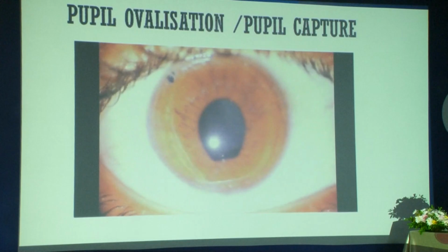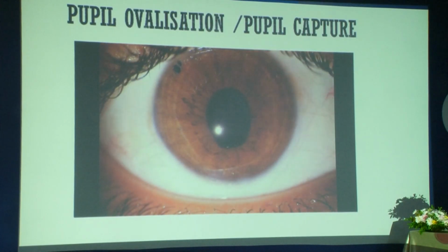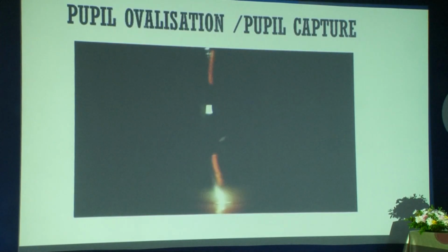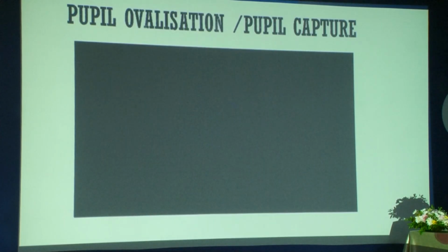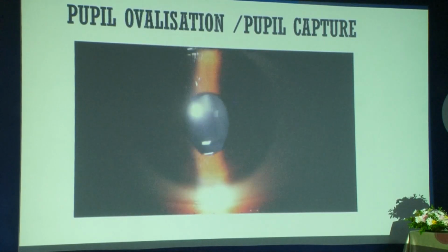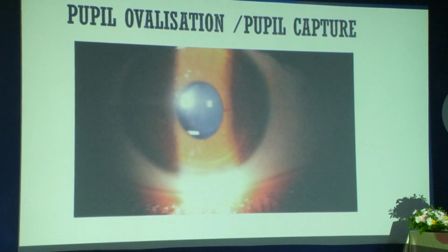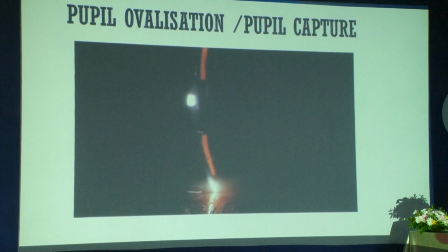Usual treatment is just miotics, and you can even try this in the OPD. You can try to make the pupil constrict and dilate in front of the slit lamp multiple times, and sometimes it gets free on its own. However, if miotics and these tactics don't work, you can always take the patient to the OT, tap the lens in the center and try to disentangle the iris. It's not very complicated, rather simple.